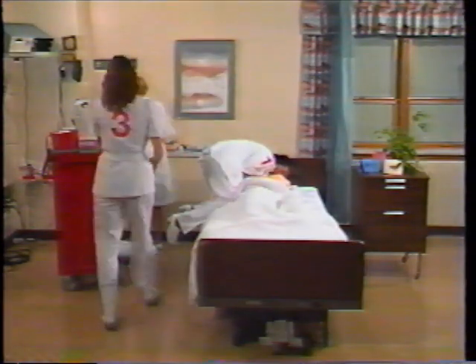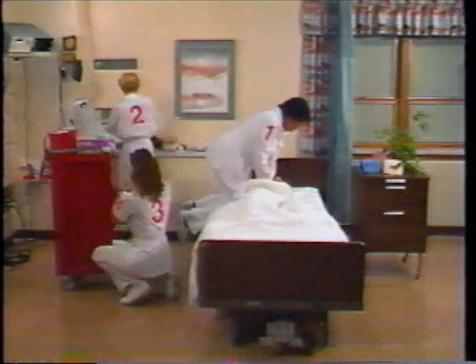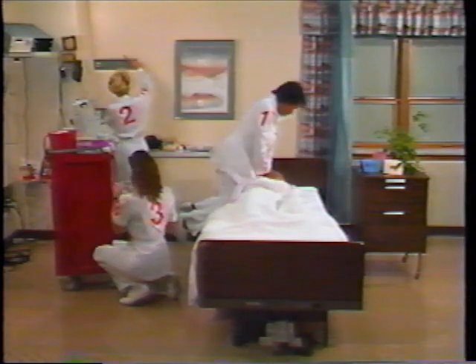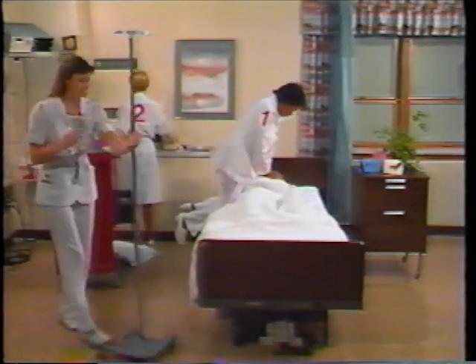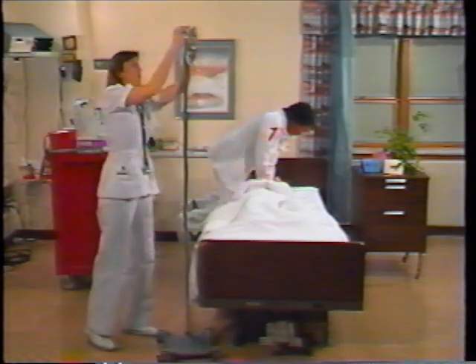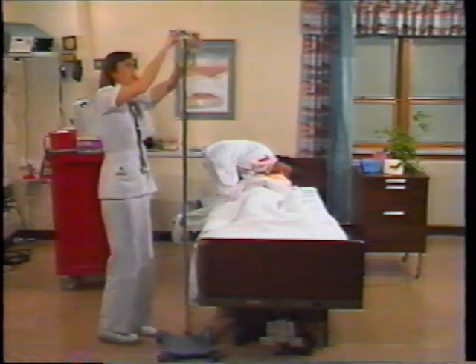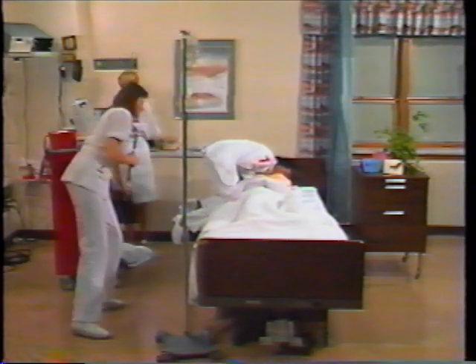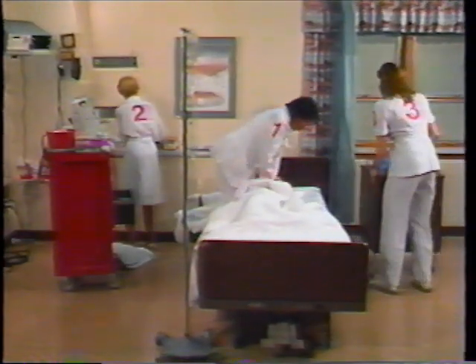When nurse number 3 responds to the emergency bell, she is told that an IV is needed. Help is also needed with CPR. She proceeds to set up the IV equipment. Can you start this IV? Sure. Since nurse number 2 is now free to start the line, nurse number 3 can assist with CPR.